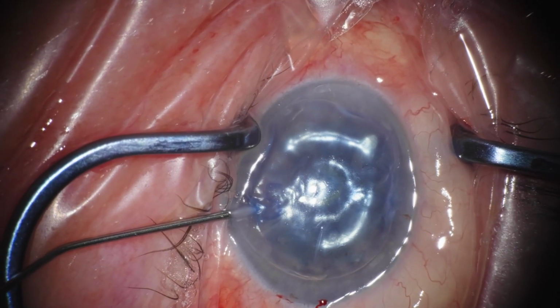You only have to inject the final air fill. And this was the purpose of the video, just to show that one of these two big complications, the fibrin and the shallow undeepenable AC, are two of the most important factors that you need to be aware of during surgery, and try to minimize the risk for posterior pressure during preparation of the patient and surgery.